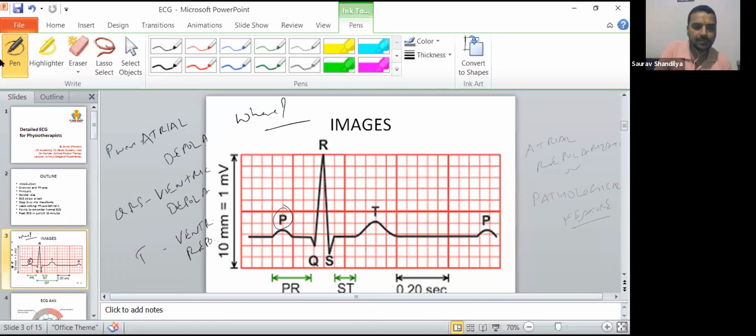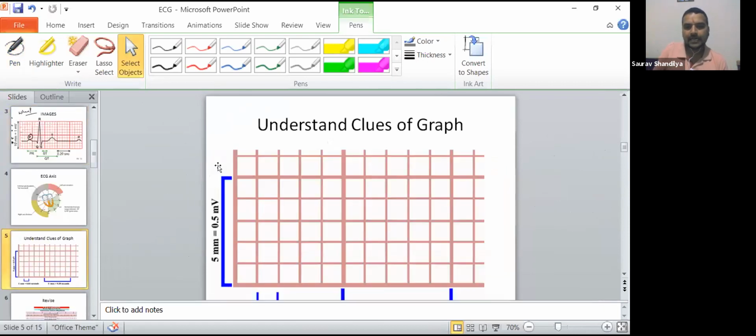So let us talk about the graph. I think I have a graph paper here. Look, this graph I have brought for you is a little bigger graph. You can see you have small size boxes, right? A small square, SS will denote a small square. If you see the bigger graph, you have 1, 2, 3, 4, and then 5. So you have 5 small squares.